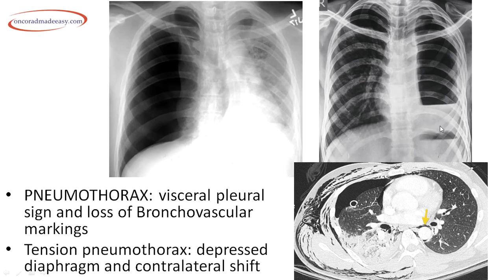When pneumothorax is accompanied by pleural effusion — showing an air-fluid level — this is hydropneumothorax. On CT of a trauma patient (lung window), you can identify normal lung parenchyma bilaterally, contusions, pneumothorax, and air in the chest wall which is indicative of surgical emphysema.